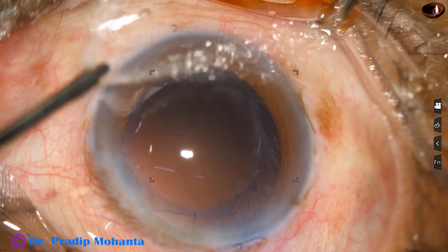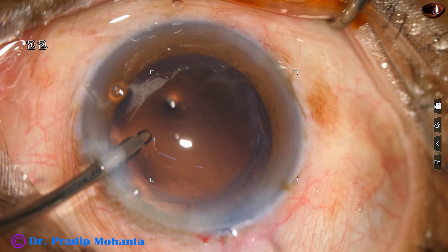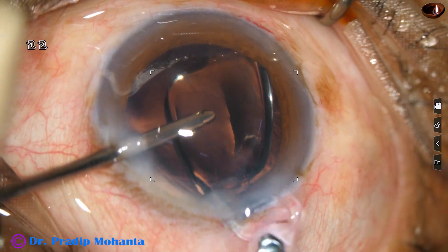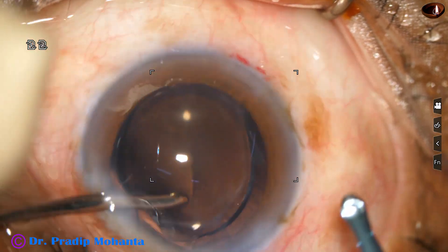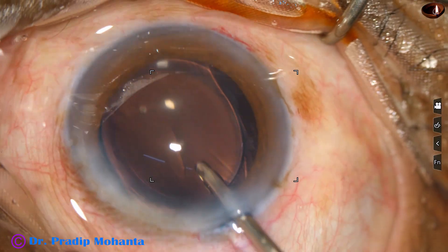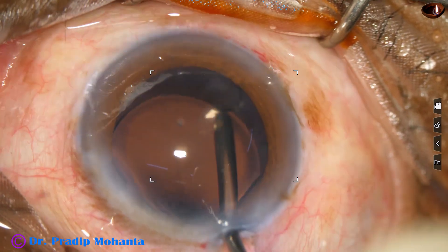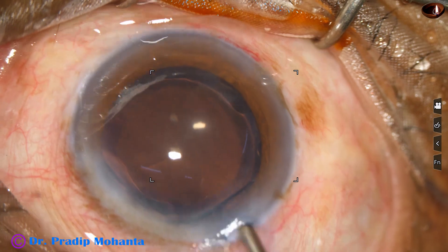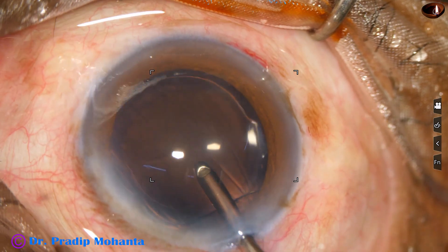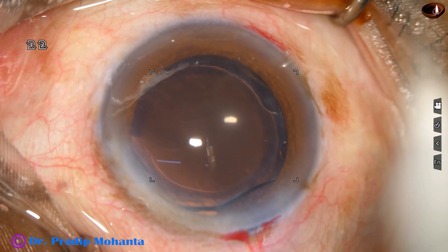The main wound has been enlarged a little bit. And now this is hydro-implantation of a monofocal intraocular lens. The lens is placed in the capsular bag. The anterior chamber is irrigated so that all the viscoelastic molecules, including those in the lumen of the cannula, come out.